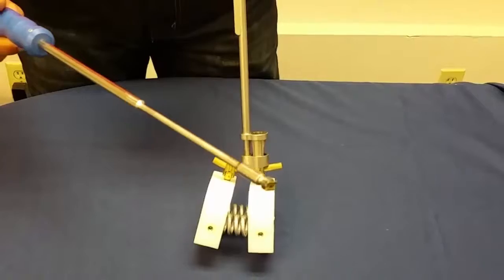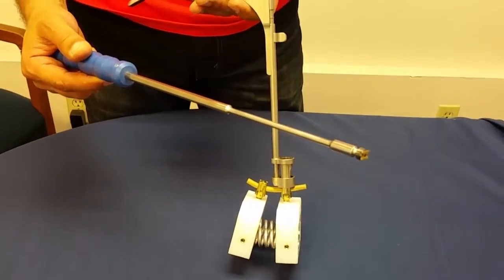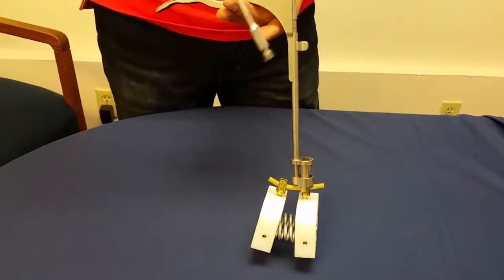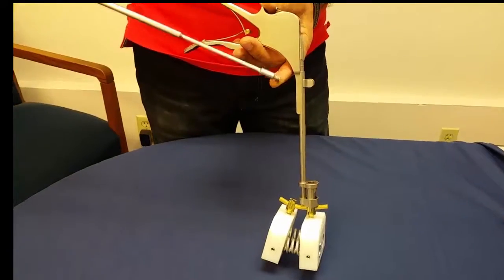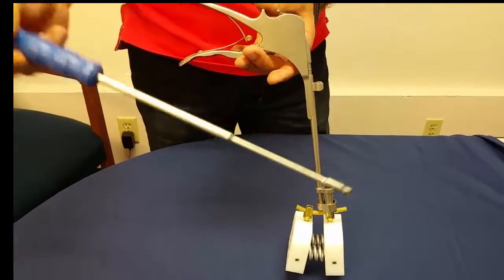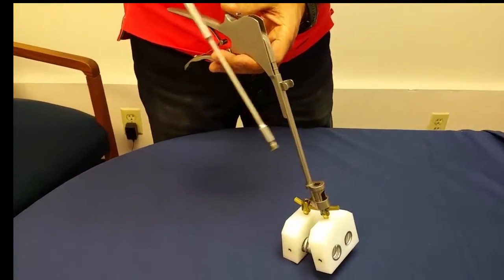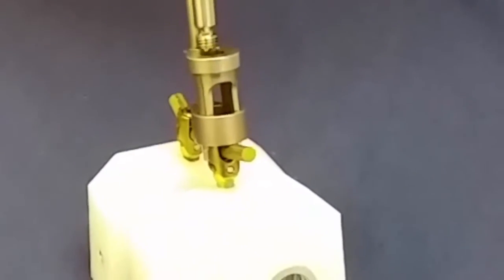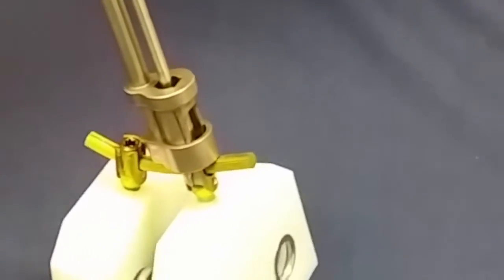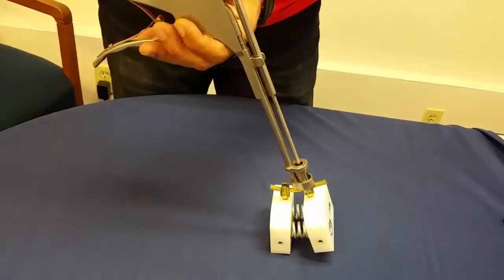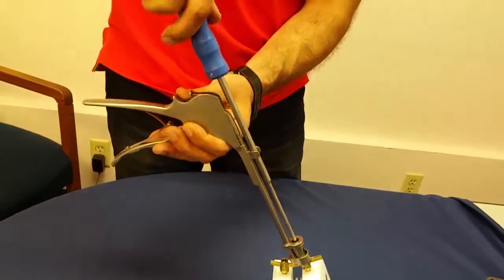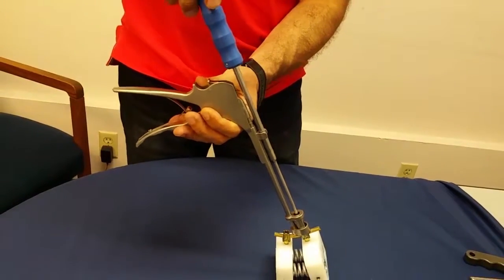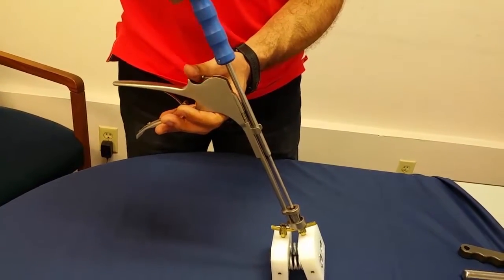At this point we take our provisional set screwdriver which holds the set screw in a friction fit so it doesn't fall out. This reduction instrument has an alignment channel to guide the placement of the set screw. The set screw is turned and as soon as you hear a couple of squeaks that's sufficient.